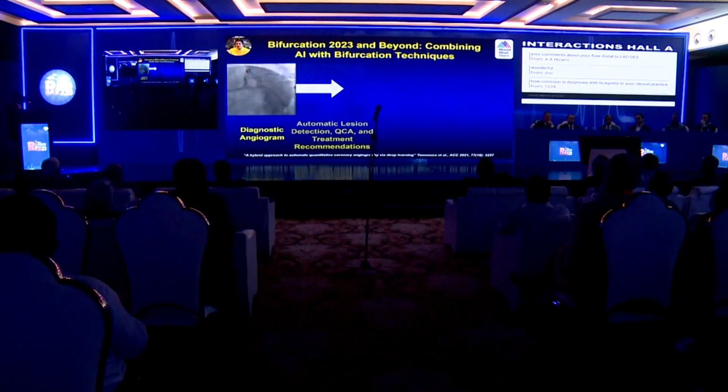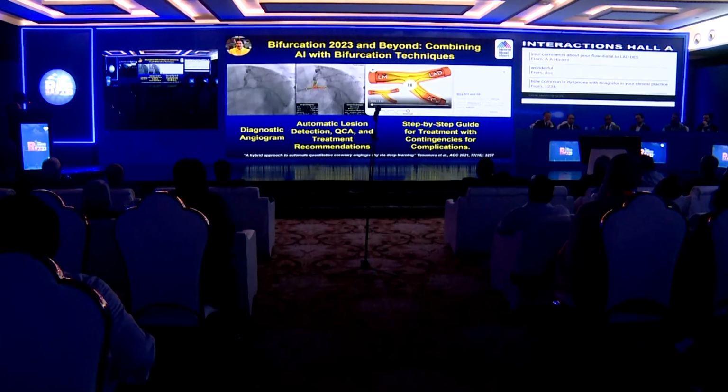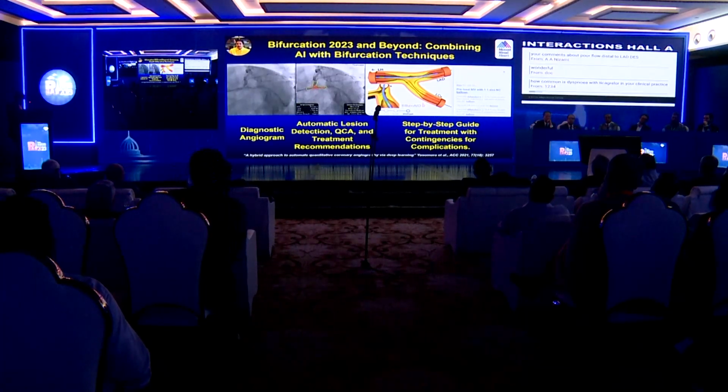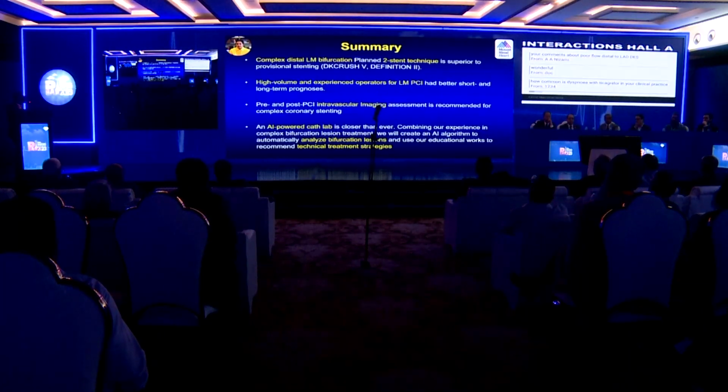So this is the future of bifurcation in 2023, which we are working on using AI, where after doing the angiogram, there will be automatic QCA detection, followed by the apps that we have created, which will tell you which particular technique is better, and a step-by-step guide for treatment of this complex PCI that we are talking about.